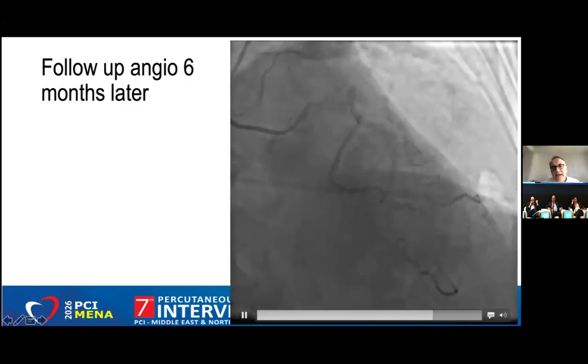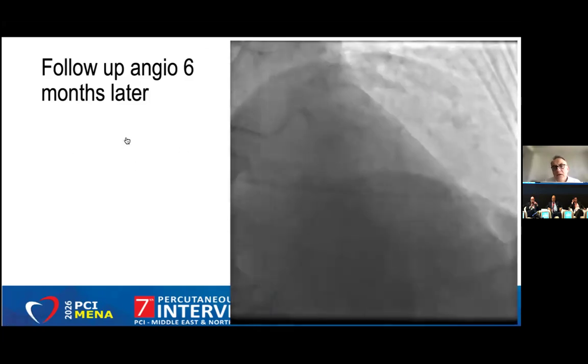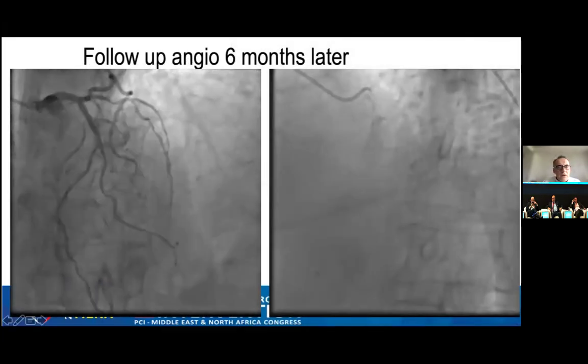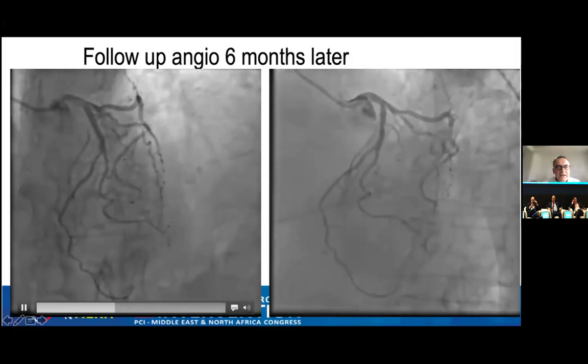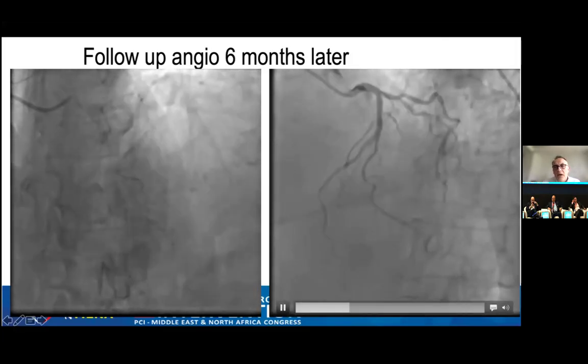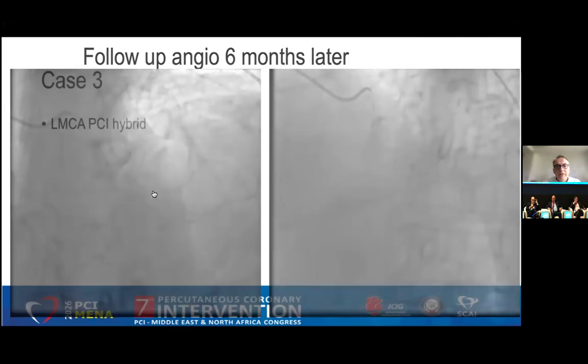It's like a stent-like result, I think. We still have some 50% stenosis, but it's a very calcified part. I'm not sure how a stent would work here. Very calcified nodule we have.